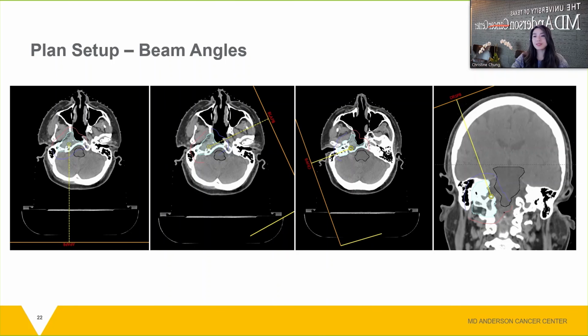All right, so here's an example of all of this in practice. The blue line is the proximal margin and the orange line is the distal margin. I worked with physics on this case to find the best beam angles. We opted for 4 of them to spread out the dose and uncertainties. Beams were picked to avoid ranging into the brainstem, so as you can see, none of them are ranging into it.